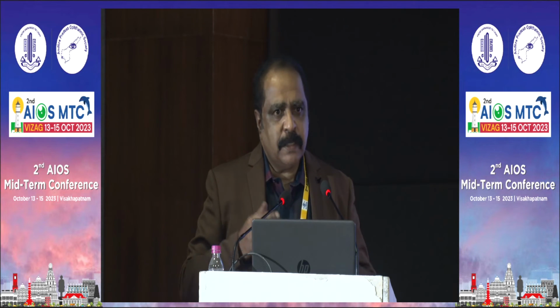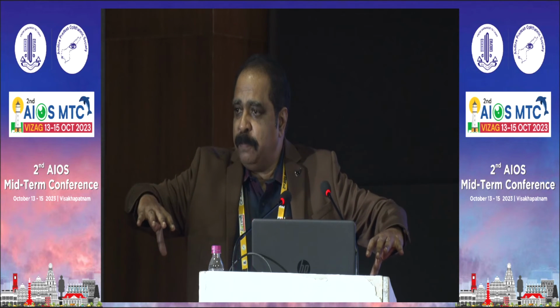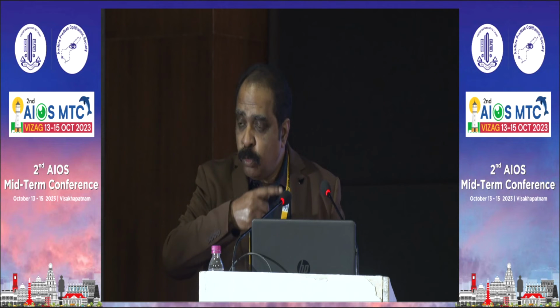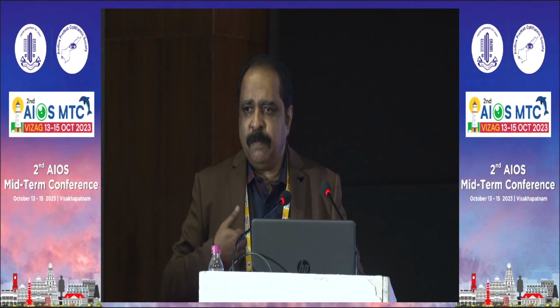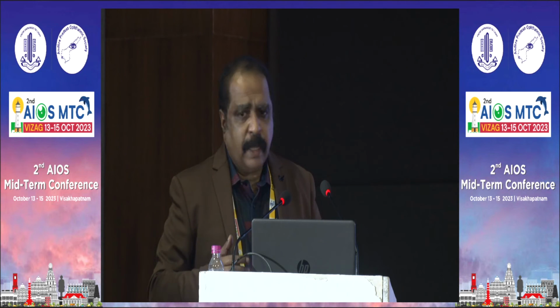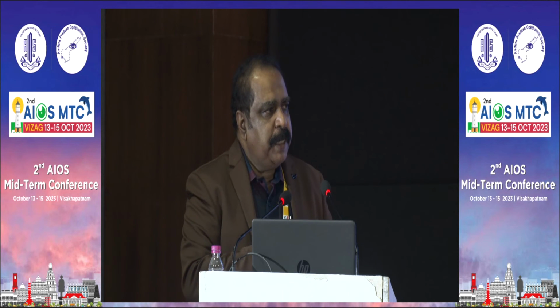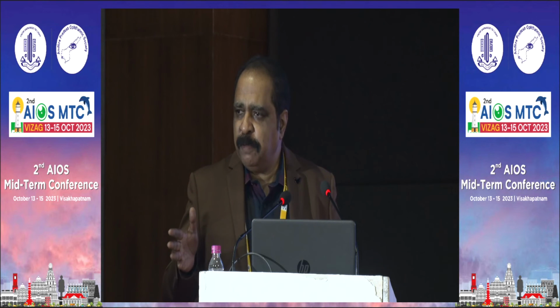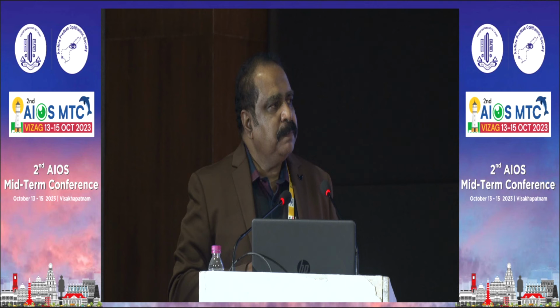I do ECCEs sometimes, when I have very bad blebs, huge blebs, very hard cataract, very old patient, shallow AC. I'll do a corneal ECCE because I have no other option, because I have learned. But especially for residents, I'm sure most of you are training people. When you are training, it's easier to teach them SICS than ECCE. Do you agree with that? Yes, it is much easier to train. SICS should also be learned.